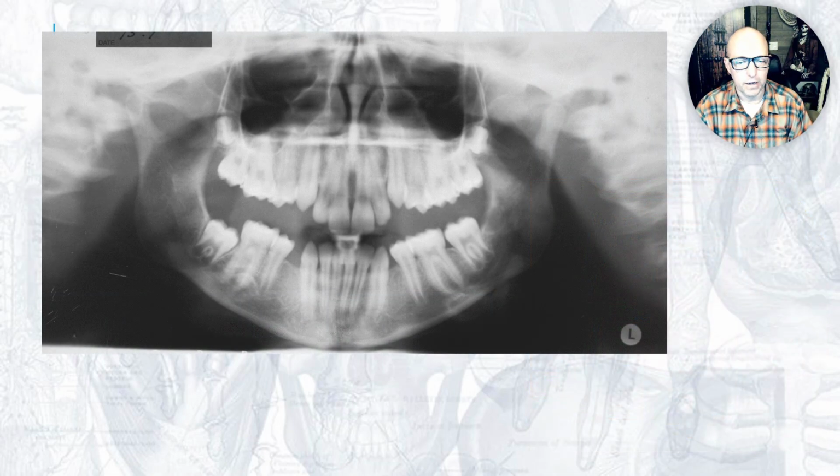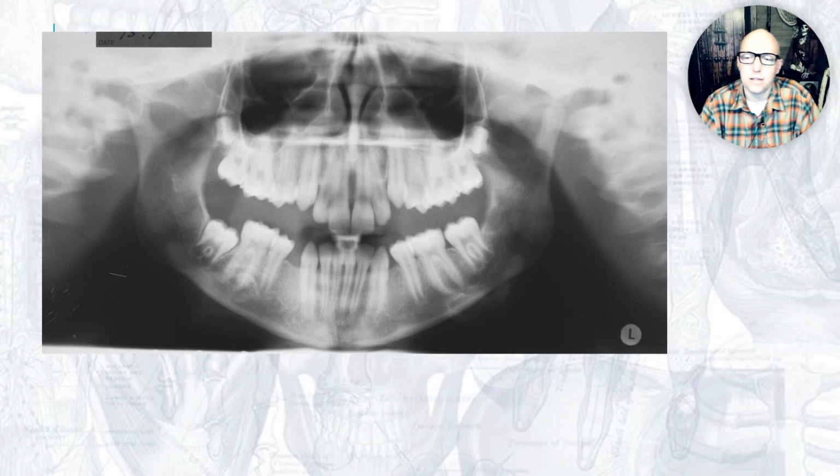And I guess I don't talk about it in this lecture. I took it out, but what should be aligned horizontally? In most panoramic machines, in our Planmeca ones, is it the ala tragus, which I know a lot of the faculty teach, or is it the Frankfurt plane? And what the heck is a Frankfurt plane? Nobody knows what it is. That's why everyone remembers ala tragus. It's not the ala tragus. If you have the ala tragus, their chin's going to be up too much. You're going to make them sad, you're going to make me sad, and everybody sad.